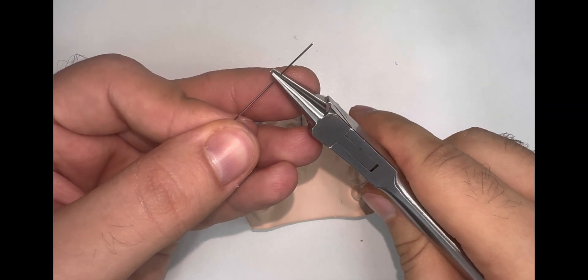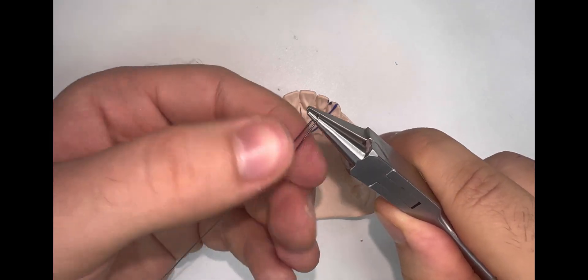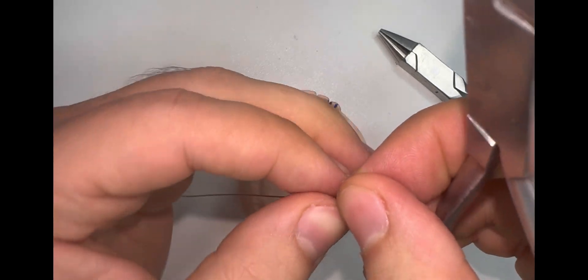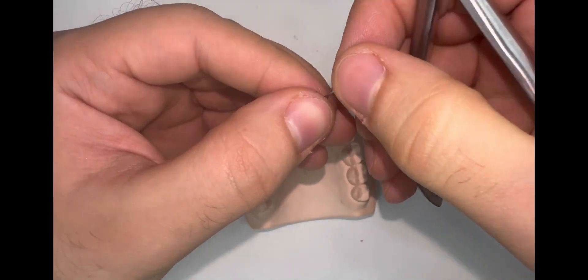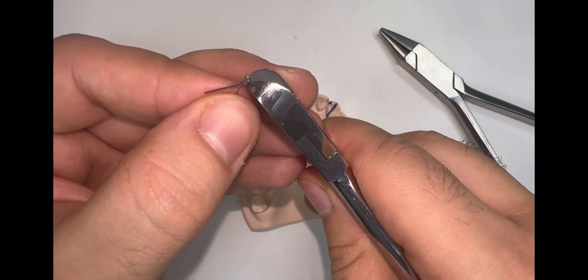So we start to do our non-traumatic coil. First, we start making a small U-loop or a small coil from the side, and continue the bend. Next, after we have a U-loop, with the Adams plier we're going to close this U-loop. This is a little bit tricky because the wire diameter is small, so it can snap from the Adams plier and you need good control. Now it's closed but we need a little bit more. Next we're going to cut the wire and re-close our coil to make it small. Remember, the non-traumatic coil should be really small.